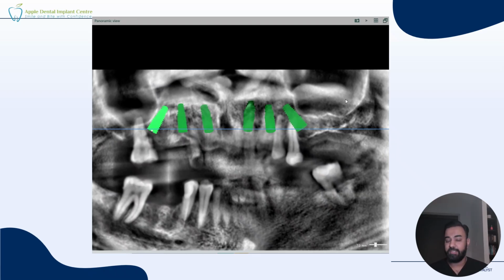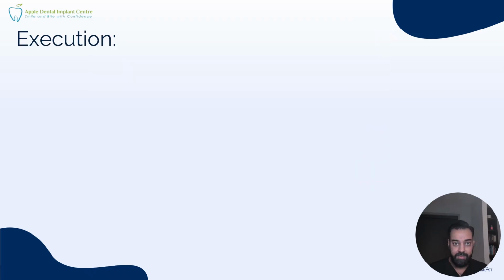From the looks of it, this would be akin to an FP1 style prosthetic, which means that we are planning to only design the teeth aspect of it and not have any gingival contours involved in our final restoration phases. Now, this is all our preliminary plan. This is based on imaging, what we saw, the measurements we took, everything else. These things can change when we start operating, and the intraoperative situation guides our hands into our final placement of implants and final outcomes as well.